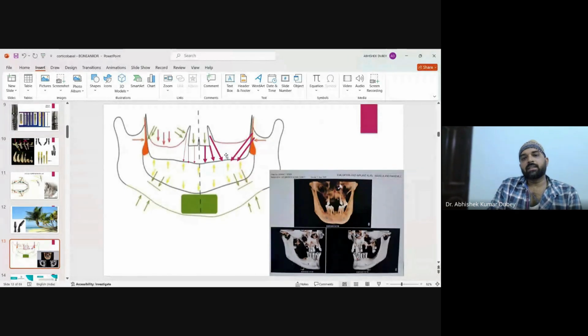So yeah, and in the maxillary area, if you see, we have the canine eminence area, and we have the pterygoid area. You see broad purple pinkish arrows. Okay, you can always distribute your implants accordingly so that the inter-implant distance is not very excessive. For say in this patient's case, okay, if I insert an implant, I don't have bone beyond 1/4 and 2/4 area.